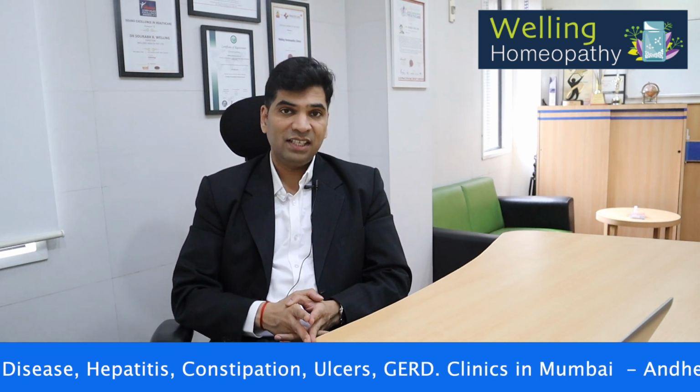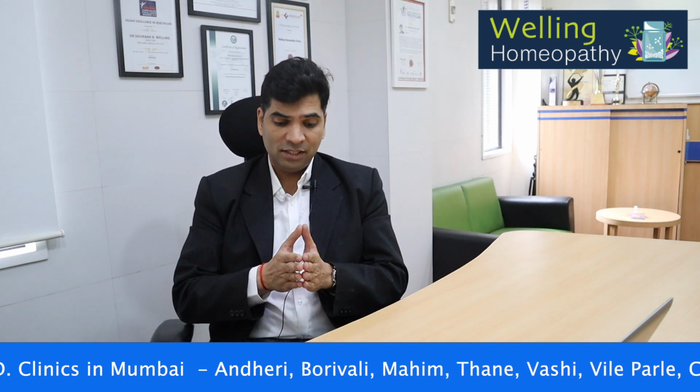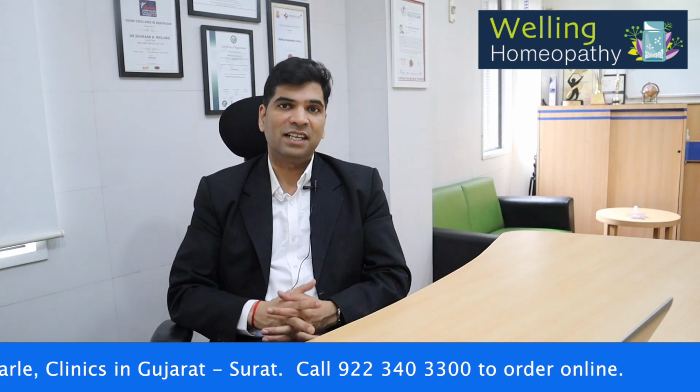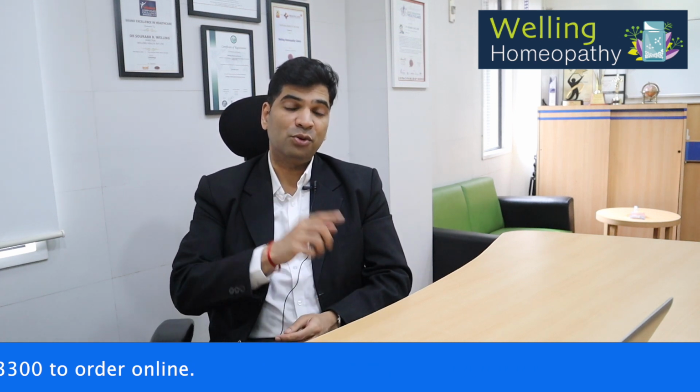Now, an ovulation kit has 2 lines. One line is the control line. This just lets you know that the test is working. The second line is the actual test line. When the test line is as dark or darker than the control line, that means the LH hormone is increasing. This is when you should start having sex for having a baby.